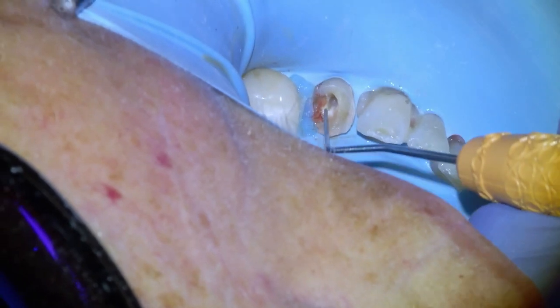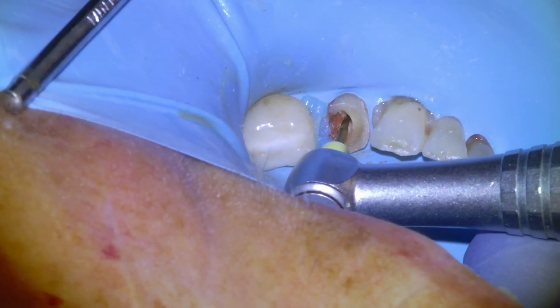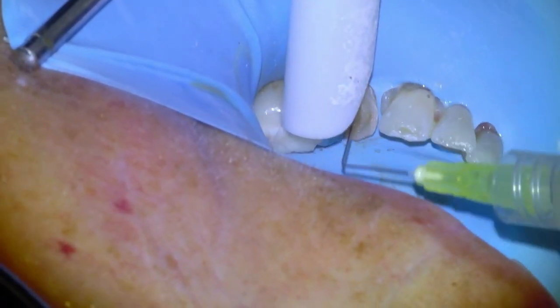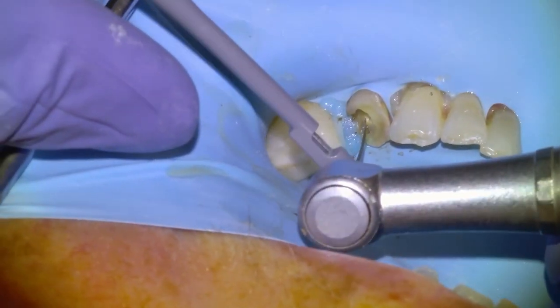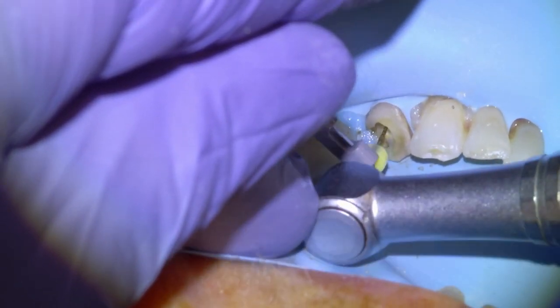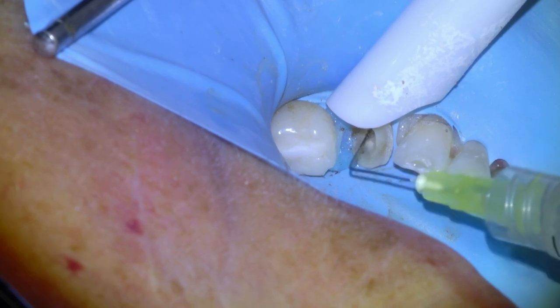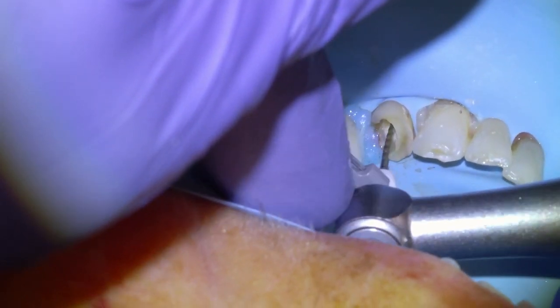Once we get a stick from our endo explorer, we're going to begin by using our SX shaping burr with some RC prep to open up the coronal third. Then we'll irrigate and begin taking our files down to length, starting with a glide path file. I'll clip the apex locator directly onto the file and then take the glide path file down to the red line to verify that we have patency out to the apex. Then we'll irrigate and begin taking the rest of our shaping files to the green line on the apex locator.